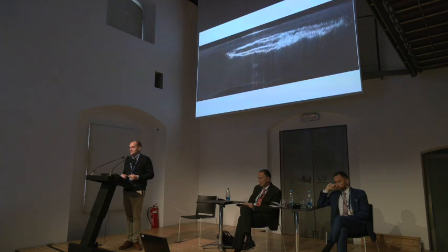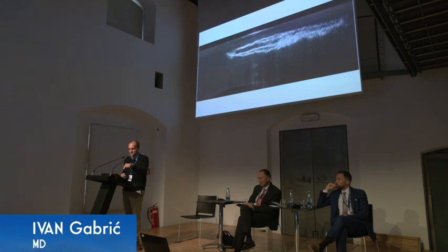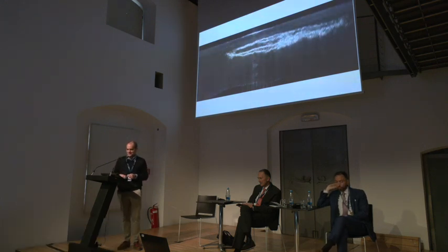Now, using the power of software and Versace's brain, we have the applanation-like view, which is very, very difficult to understand because sometimes you think you got Bowman undulations, but you just got epithelial irregularities. You need to fix that.